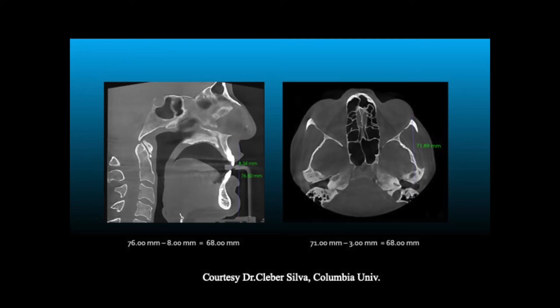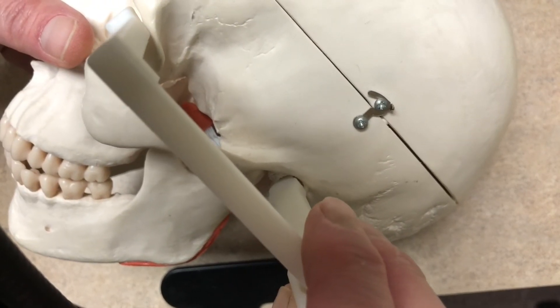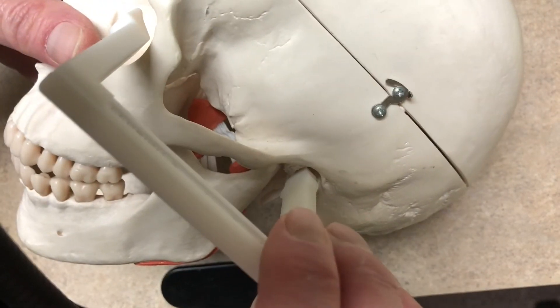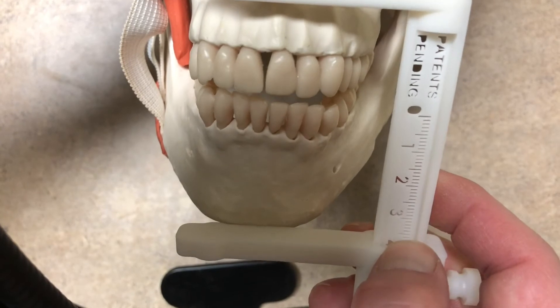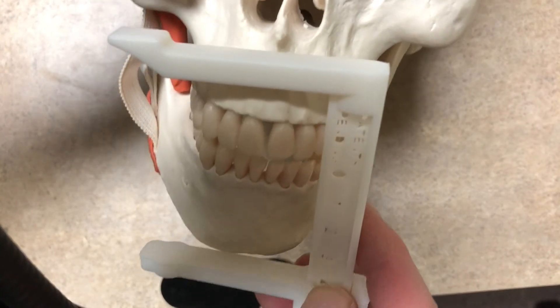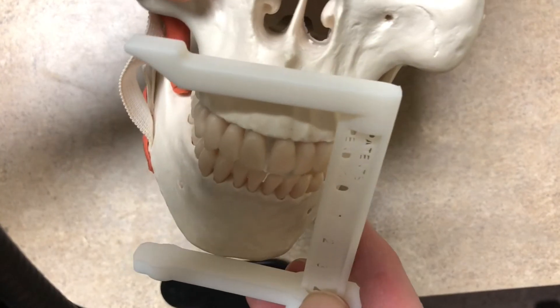This was proven by Dr. Silva at Columbia University. You go from the ear to the corner of the eye, then turn the caliper — the V-Doc. There's a small step down and you measure from under the nose to under the chin, which are bony landmarks. And that's all there is to it.